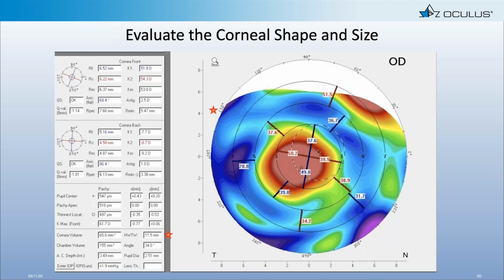So always take the time to look at this part of things and understand the cornea. Even though I'm fitting a scleral and all of the landing is going to go on the conj and on the sclera, I still want to understand the cornea, so I make sure that as I vault that tissue, I'm vaulting it in proper alignment to the shape of the eye.